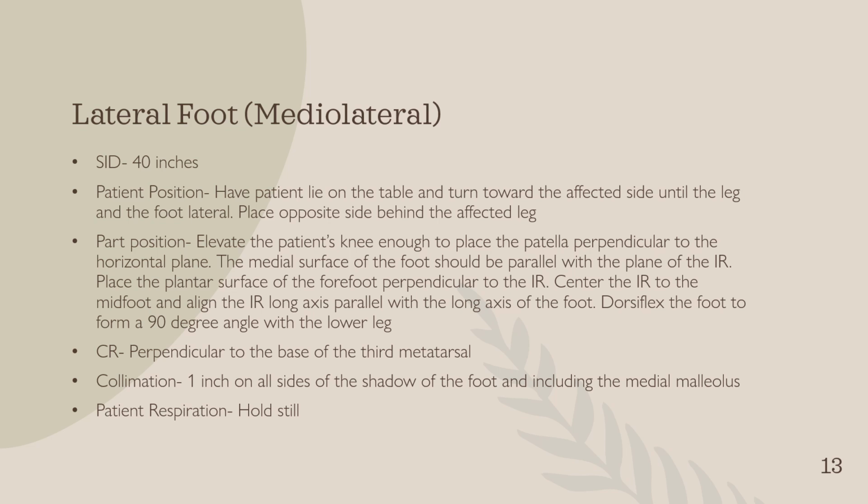Projection is the lateral foot, the mediolateral. The SID is 40. Patient position. Have the patient lie on the table and turn toward the affected side till the leg and foot are lateral. Place the opposite side behind the affected leg. Part position, elevate the patient's knee enough to place the patella perpendicular to the horizontal plane. The medial surface of the foot should be parallel with the plane of the IR.